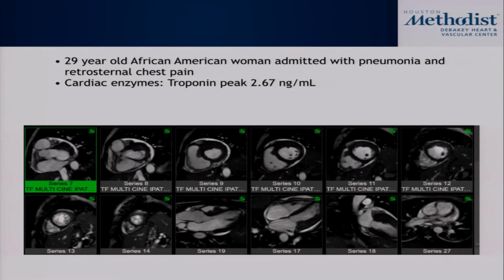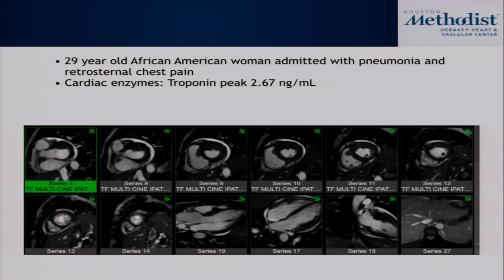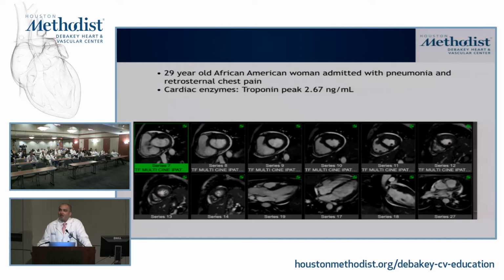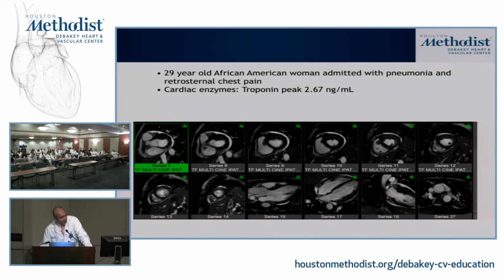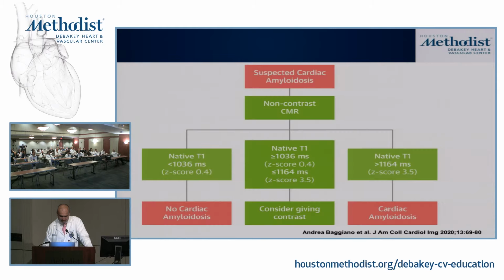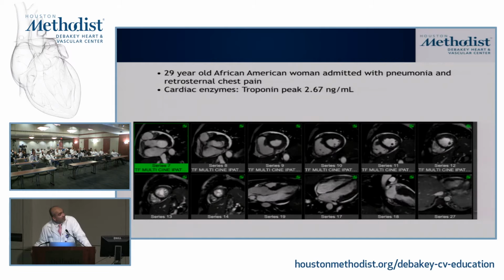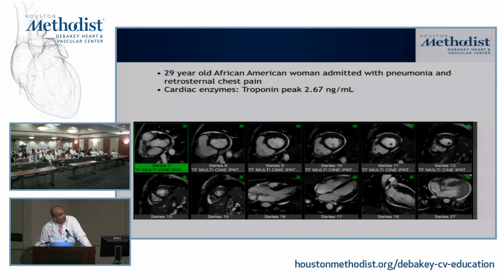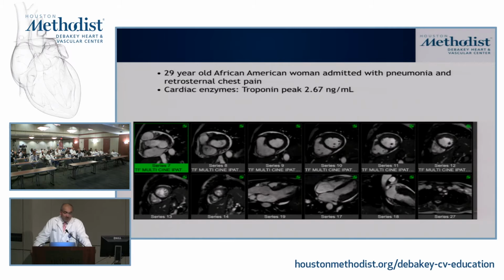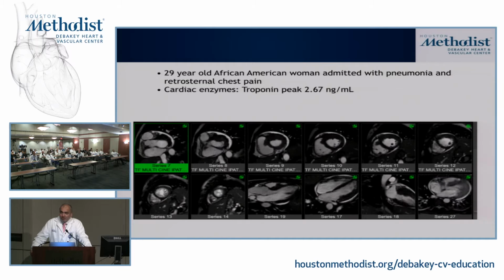So we've called on Chanushri a few times, so let's call on somebody else. Tell me what you see. One of the second-year fellows? Peter? Sure. So there's LV wall. Okay, let me play this again. I'm not sure why it stopped. Whoops. Okay. So there's LV that's asymmetric. Okay. It's more anterior. Right. So it looks like it's more anterior, right?